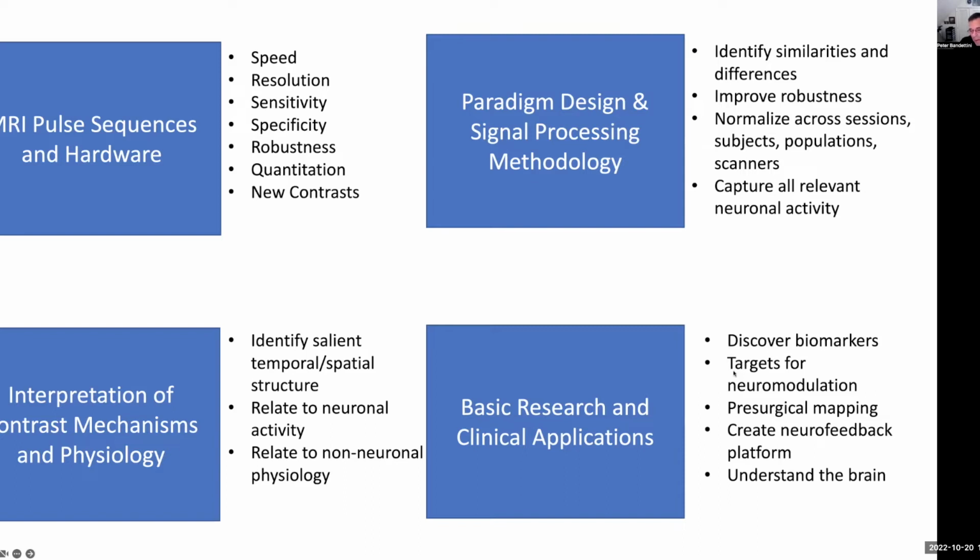Already people like Michael Fox are using it for targets for neuromodulation, which I think is a great potential clinical application. I think it has some real traction. Pre-surgical mapping is already in place. Platform for neurofeedback. Neurofeedback actually has been surprising to me. I never thought it would work as well as it seems to be working. So it might be a real method for therapy.